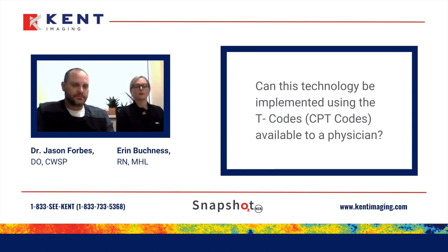Okay, that sounds easy enough. Can this technology be used and billed using the T code in a physician's office currently? There are multiple codes. Right now we use 2 codes within our clinic. It's the actual obtaining the image and then the read of the image. But there are other T codes. The NIRS company we work with have a great resource, but there are currently 4 T codes that can be applied with obtaining the NIRS images, yes. And one is in a physician's office.